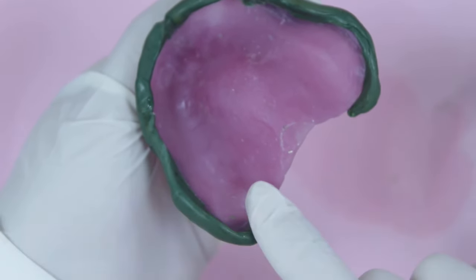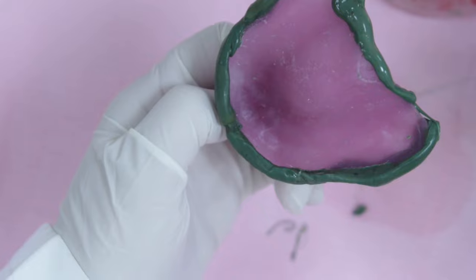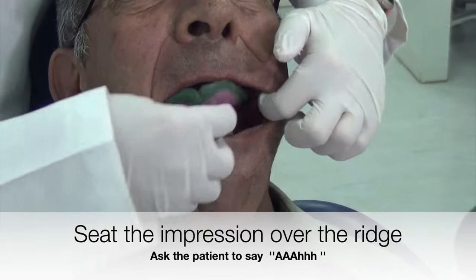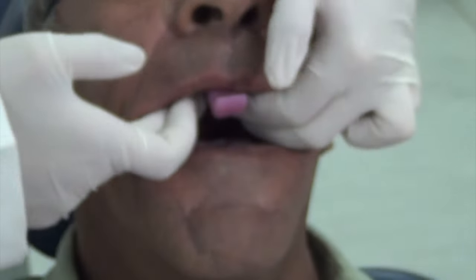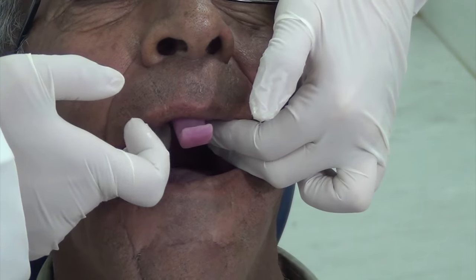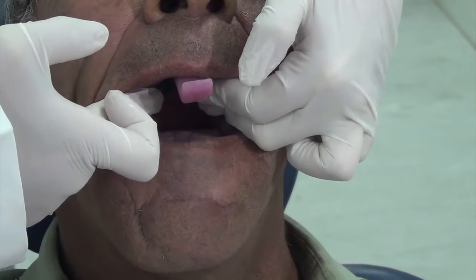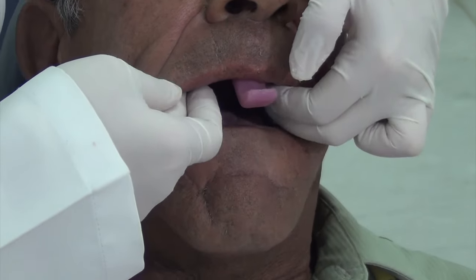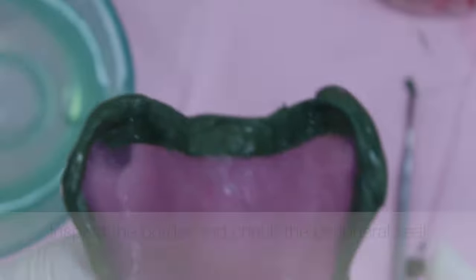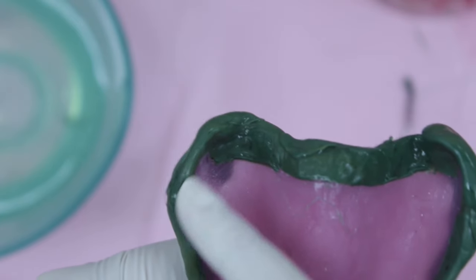The final area to border mold is the hamular notch and the vibrating line area. Apply the material as instructed previously and introduce it to the patient's mouth. Ask the patient to move their jaw to the right and left sides, in addition to saying 'ah' out loud. This will move the soft palate and help record the posterior vibrating line. Inspect the tray borders — the notch of the pterygomandibular raphe can be noted.